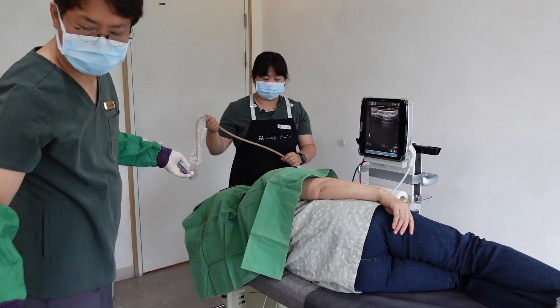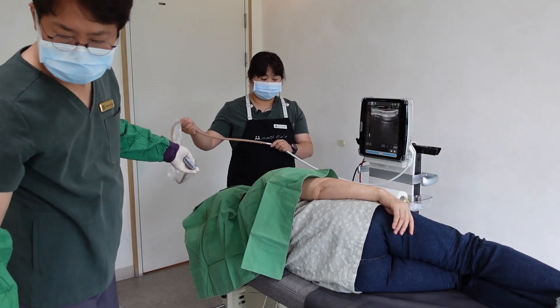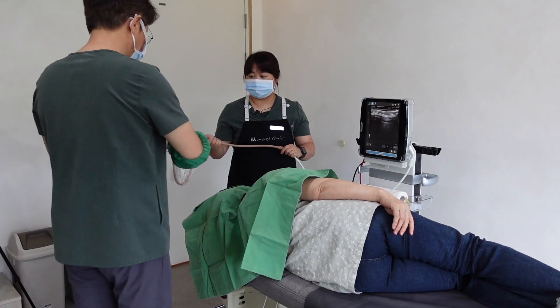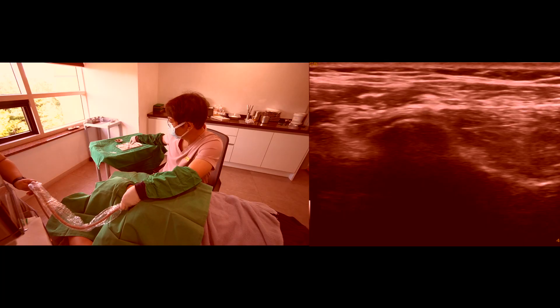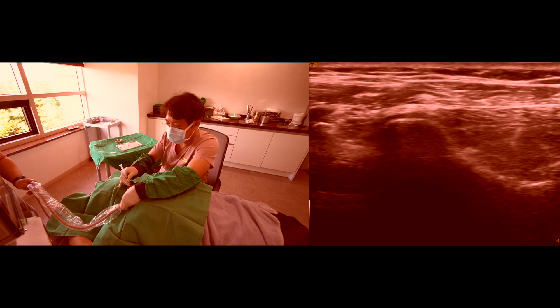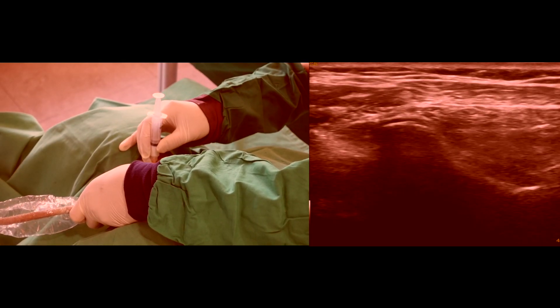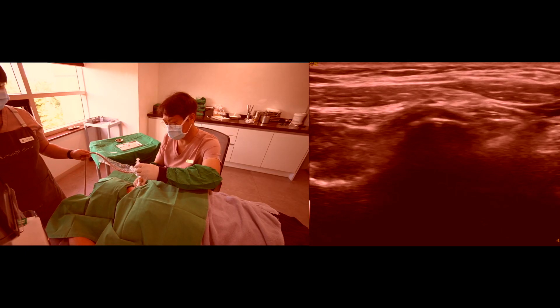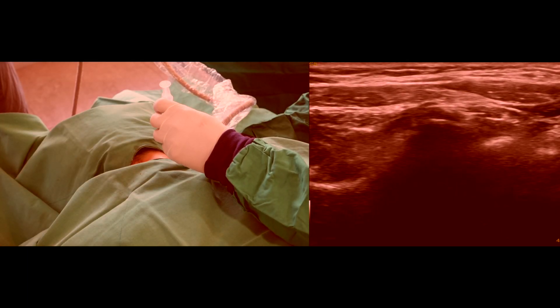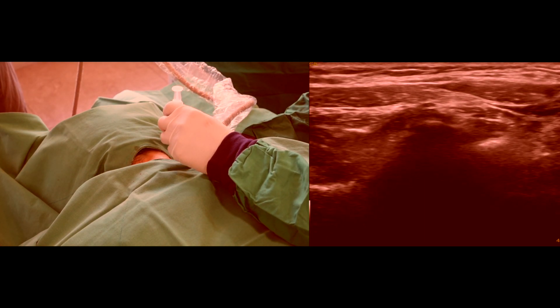My target is the right cervical C3-4 and C4-5 facet joints. Let the patient have a lateral decubitus position with the target side upward. I do not recommend the prone position. In a prone position, the needle trajectory in the body is usually farther than in the lateral decubitus position. The longer the needle pathway, the more challenging it is to control the needle, and it is more awkward to manipulate and more painful.